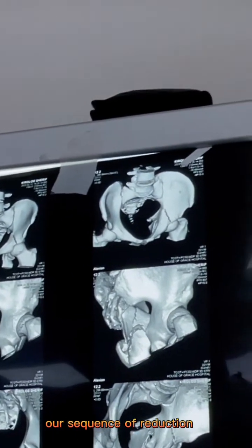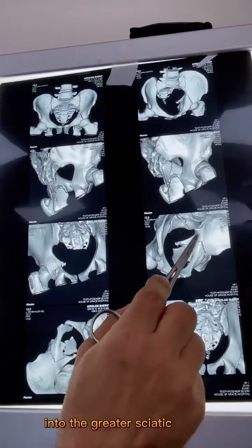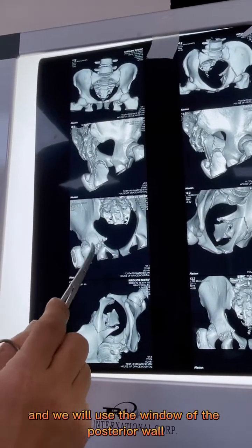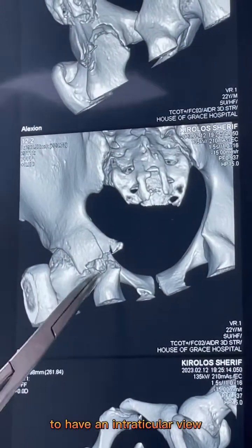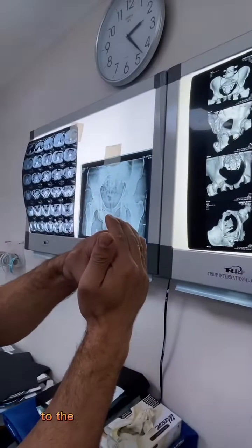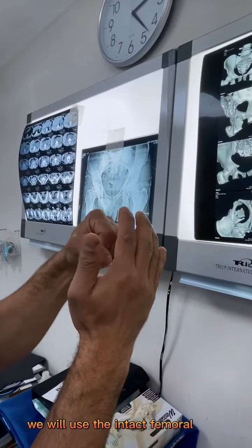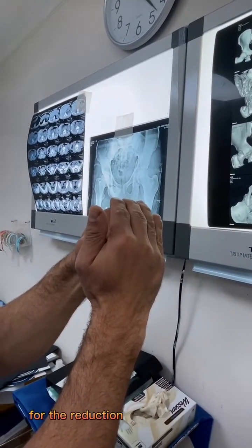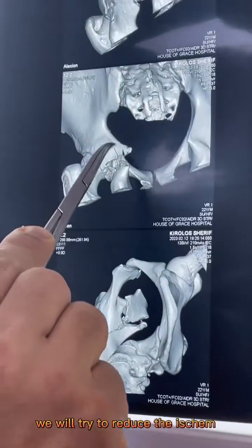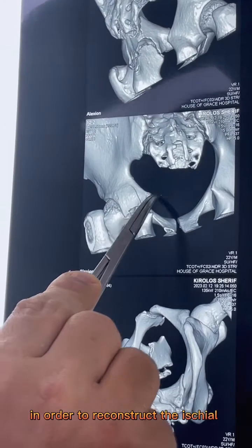Our sequence of reduction is, we will try to fix the ischium into the greater sciatic notch, and we will use the window of the posterior wall to have an intra-articular view. So the tip is that the femoral head should always be congruent to the articular surface of the acetabulum. So we will use the intact femoral head as a template for the reduction of the acetabular part. So we will try to reduce the ischium to the greater sciatic notch in order to reconstruct the ischial spine.